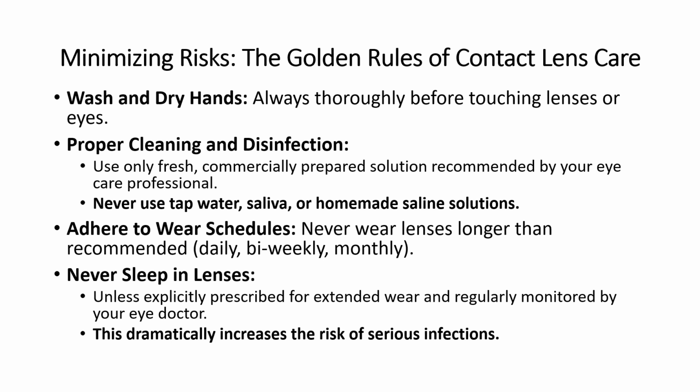Second, ensure proper cleaning and disinfection. Use only fresh, commercially prepared contact lens solution recommended by your eye care professional. Never, and I mean never, use tap water, saliva, or homemade saline solutions for cleaning or storing your lenses. These are incredibly dangerous.